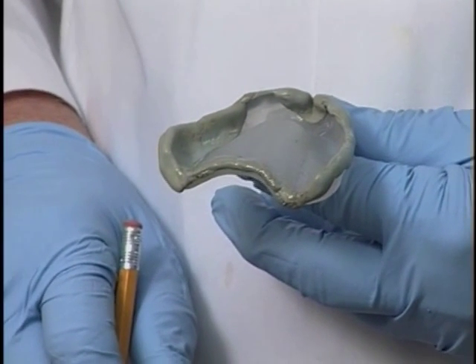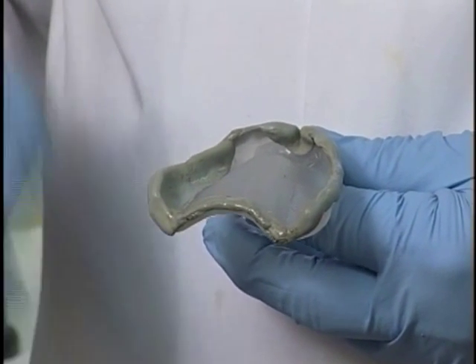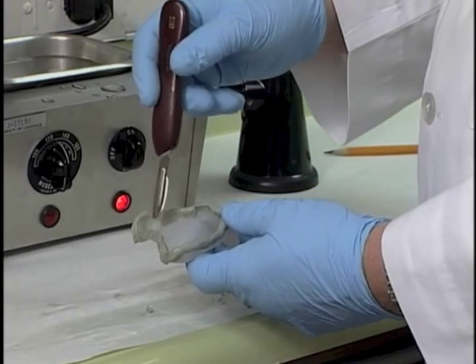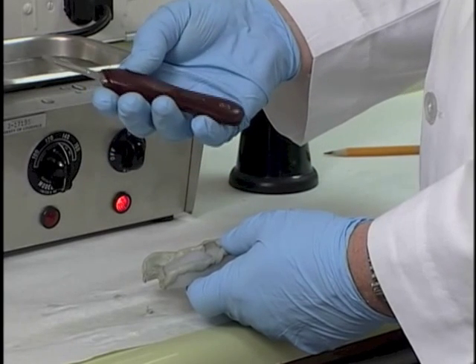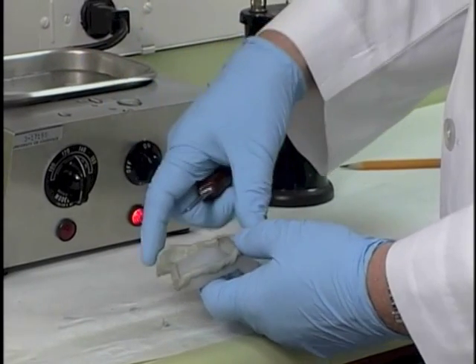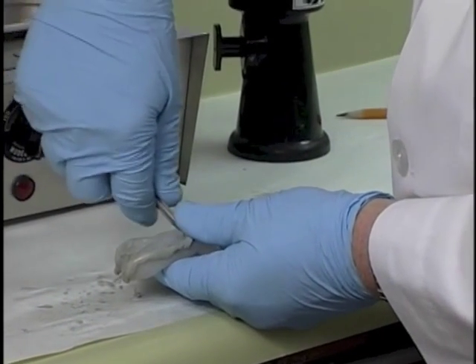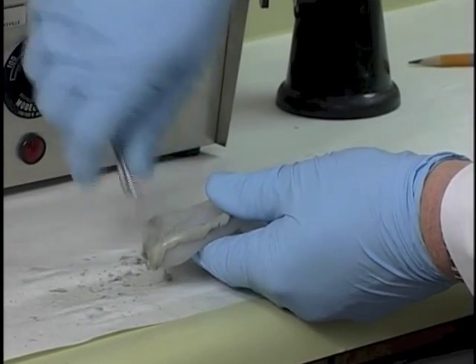We have a couple of other spots around here where a little bit of the compound has creeped down within the tray. So what we're going to do is to take a Bard Parker knife with a very sharp blade and trim this excess material from the inside of the tray. To trim the excess compound from inside of the tray, you need an extremely sharp knife. So I like to use a Bard Parker red handle knife like this with a good new sharp blade in it. And all we do is trim these vertical walls to get the excess material that's creeped down on the inside of the tray, to get rid of that material.